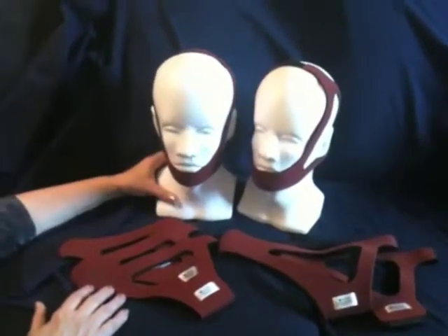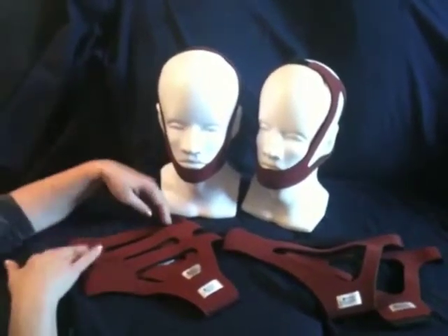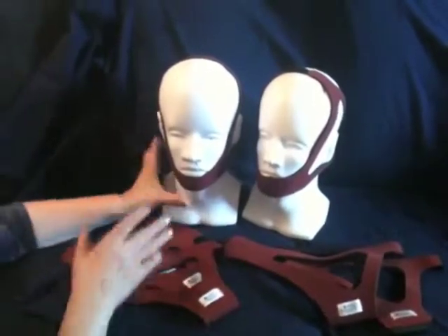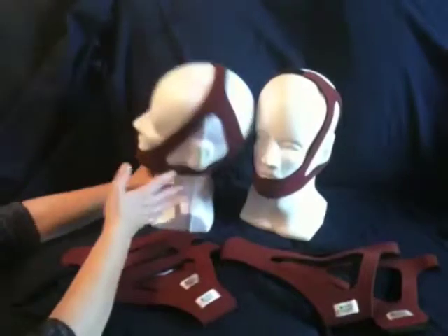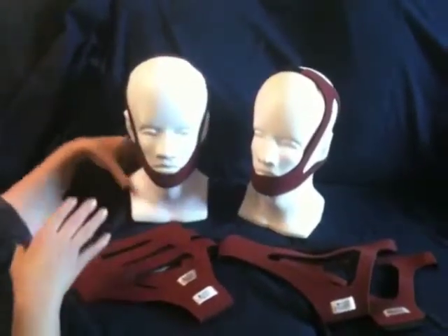It prevents skin irritation at the point of contact. It comes in small, medium, and large fixed sizes, which means there are seams and they're sewn together, so it's size specific for a patient's head.